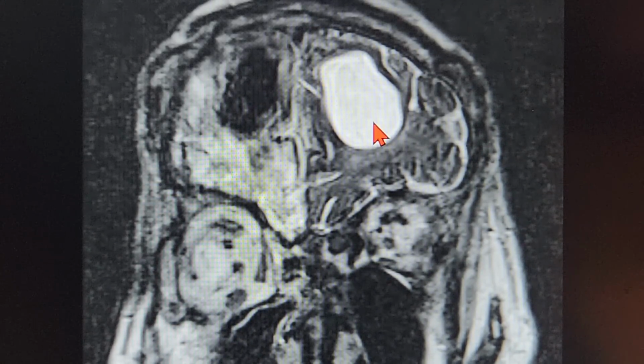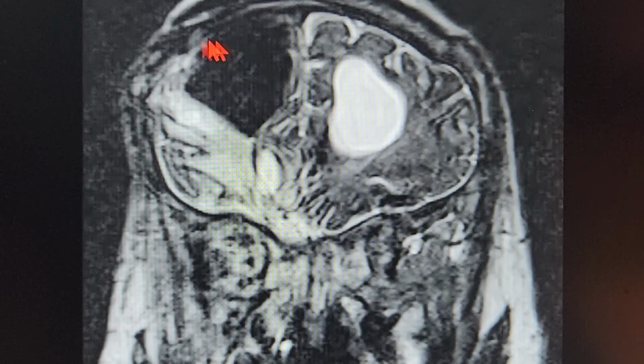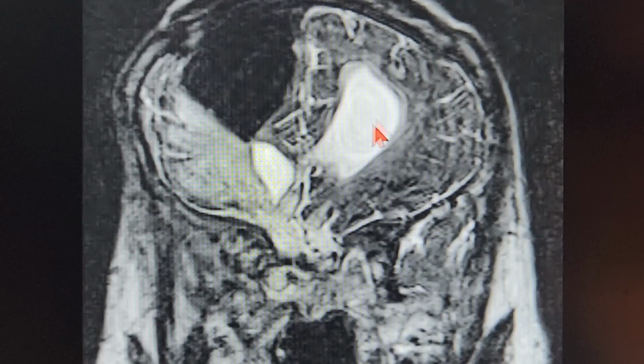Now the ventricles on this patient are completely widened up. They are huge ventricles for this patient. The patient also has some kind of hydrocephalus, raised ICT. So you can see that's a huge area of the air foci on the MRI intracranially. So that's the pneumocephalus basically, and that's the dilated ventricles in the patient's brain, the lateral ventricle basically.